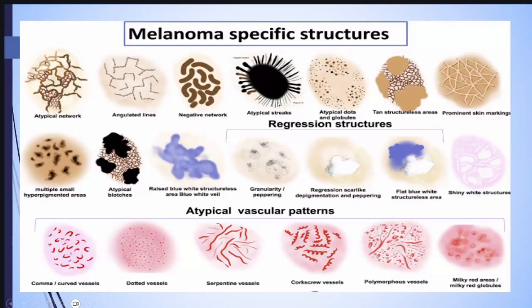And these are the things which I told you. You remember, we saw the Spitz nevus having all these atypical streaks around. So there, sometimes you have atypical streaks. The same thing, you have some atypical streaks. Now, oh my God, that's not Spitz, it's melanoma. So that will be the alarm signal for me. If I just see through a lens, probably only this and this I'll be seeing. I need a better software to have a better visualization. And for comparison, maybe 1 month back it was just simple streaks, and now there are some atypical lesions here. So that is a red flag for me. So these types of vascular patterns have to be fed into the software. See, these are the things which have to be compared.